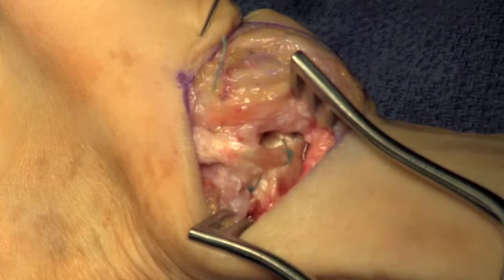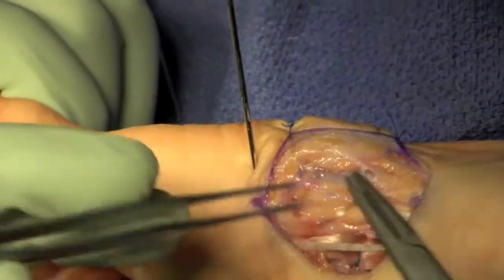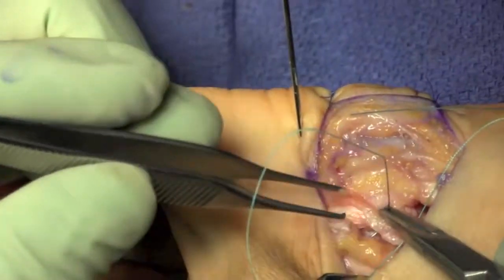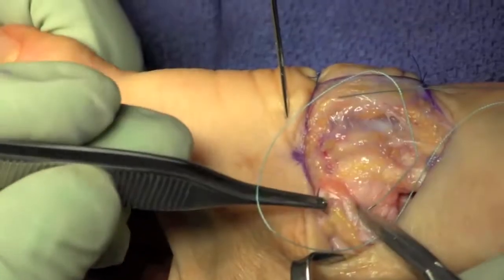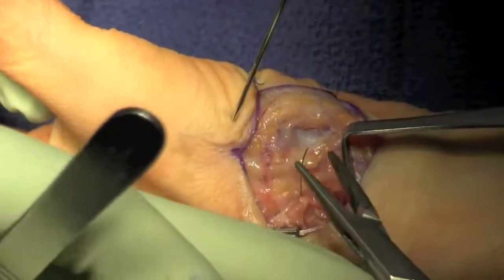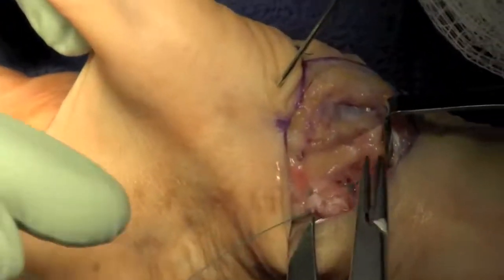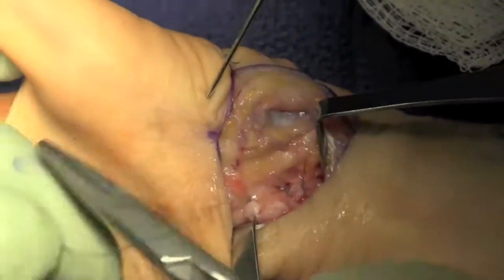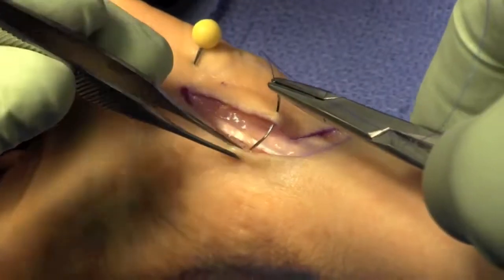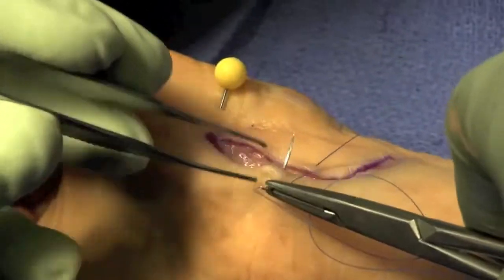The capsular tissues are closed. The skin is closed with 4-0 Novaphil, and the patient is placed in a thumb spica splint.